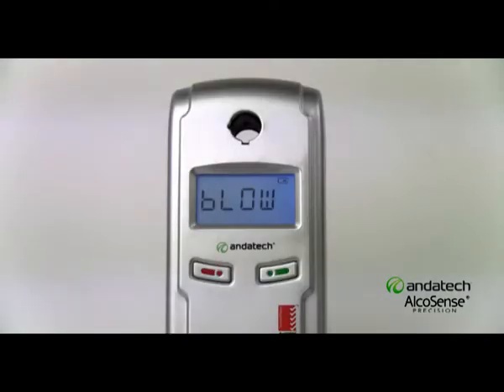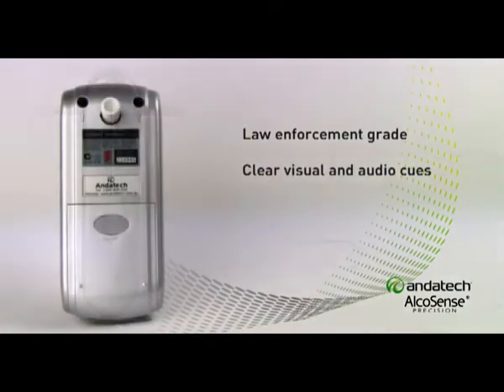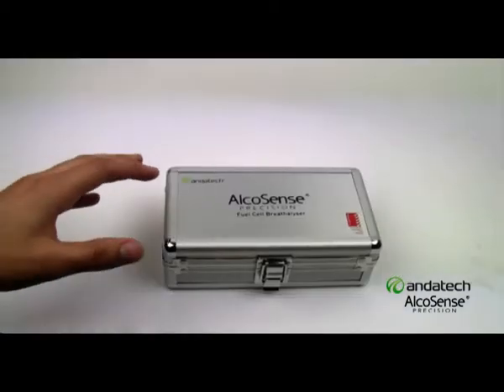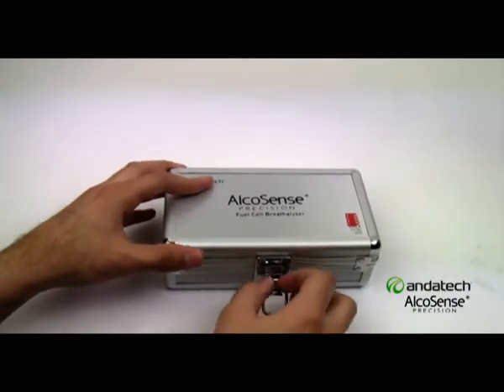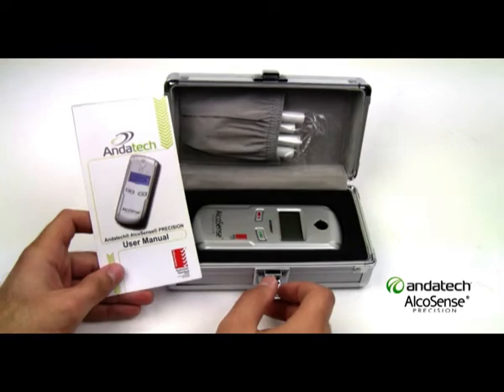The Andertech AlcoSense Precision. Law enforcement grade technology integrated into a modern and durable design. Packaged inside a solid and secure aluminium case, along with five mouthpieces and an easy to understand user manual.